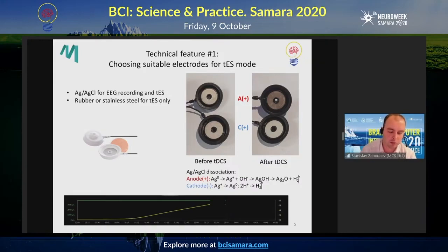You need to use either very small currents of microamperes, 100, 200, up to 500, and then it will be lower. There will be oxidation, of course, if you use the same electrode, but the overall lifetime of the electrode will go up.